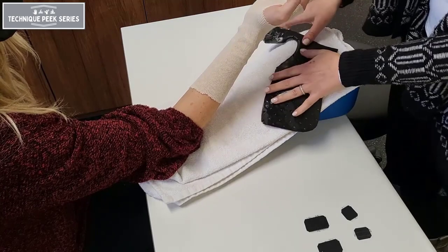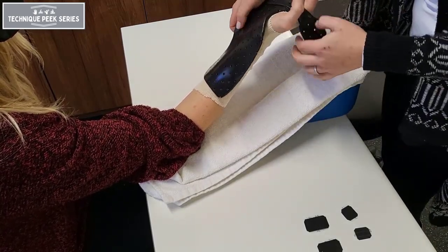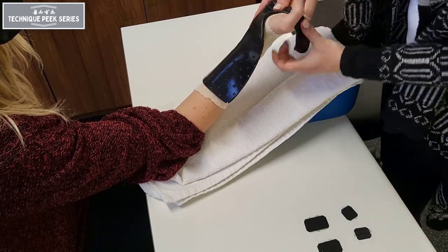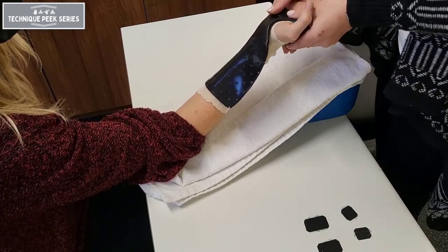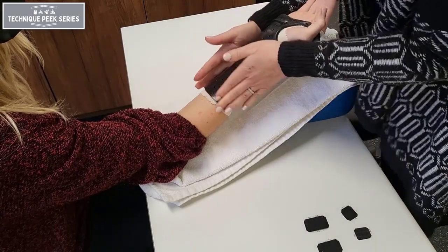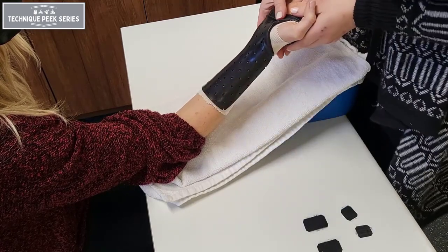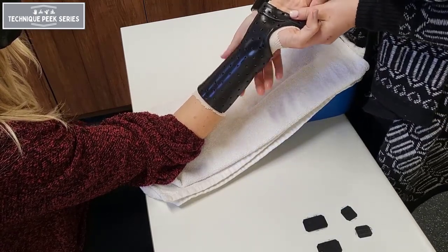Place your patient in a palm up position for molding. Drape the material over their arm. Start distally and work proximally using long sweeping strokes. Use this time to make sure the distal palmar crease and the thenar eminence are completely clear.